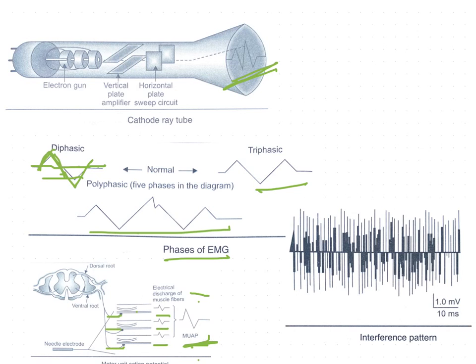Now if you see the normal motor unit characteristics, or sometimes the nerve potential of a normal motor unit, they are very small, 20 to 200 microvolts in amplitude, with a short duration of 1 to 3 milliseconds, and they have diphasic waveforms with an initial negative phase, which are observed in the motor end plate region of the muscle.